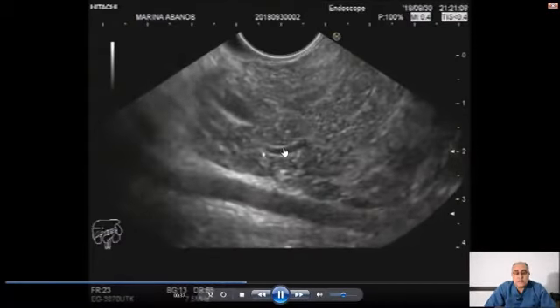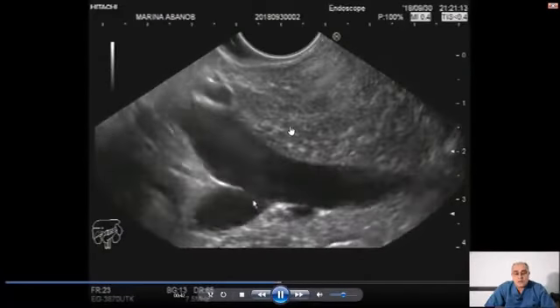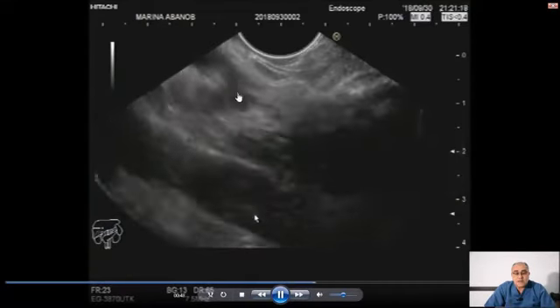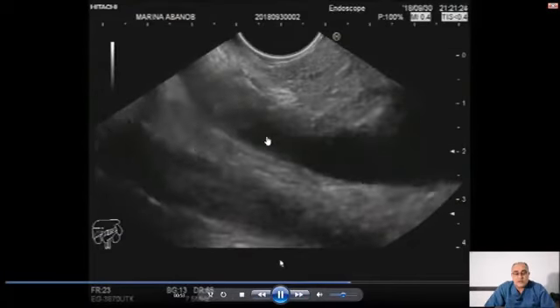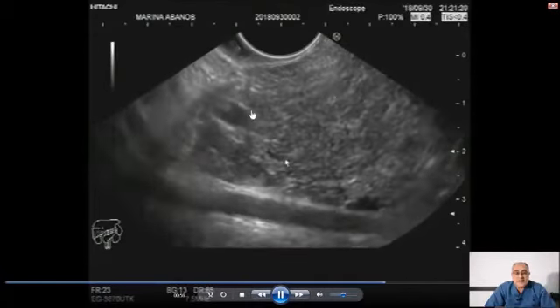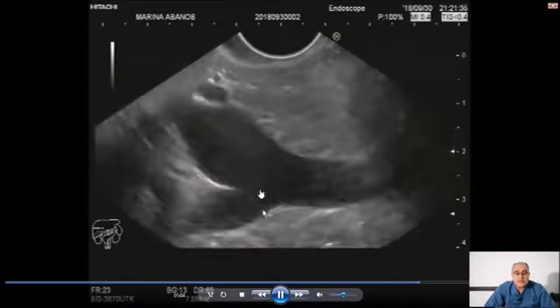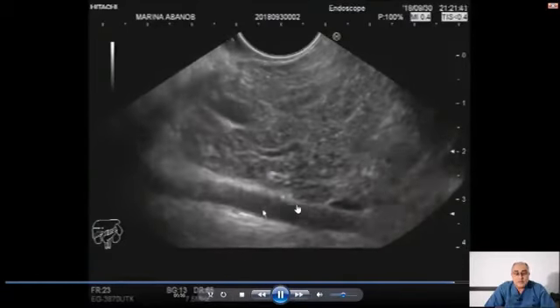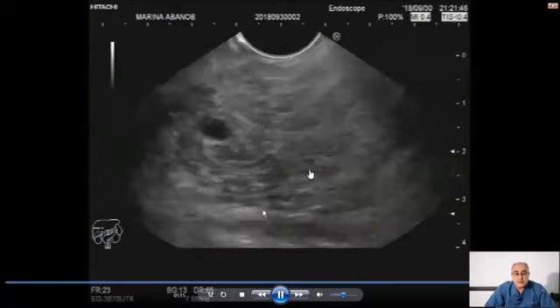More and more slight gradual clockwise rotation. After seeing the venous confluence, I can see the aorta and the inferior vena cava. So with more and more clockwise rotation, I can see the large vessels, aorta and inferior vena cava, and then with slight anti-clockwise, I can see the common bile duct, pancreatic duct, venous confluence, and the superior mesenteric artery. This is seen in the bulb with a slight push to see the bulb and postbulbar region in station 3.